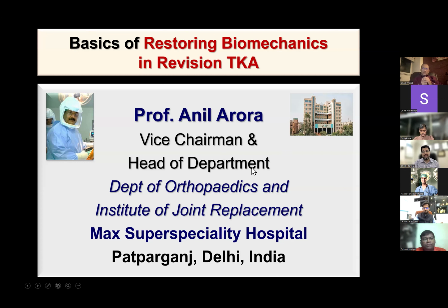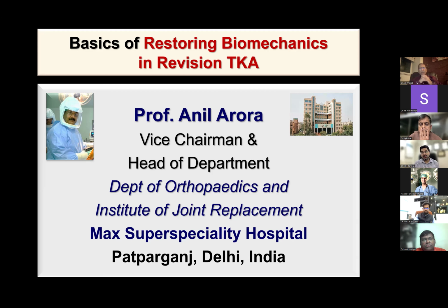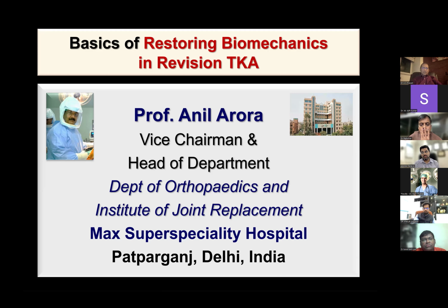How do you use cement for fixation in a revision TKR scenario? Normally, I use an uncemented stem, because a cemented stem will be the exception. Okay. And I saw the case where you put cement in that sleeve. Can you shed some more light on that? Actually, the smallest size of sleeve is to be cemented, so that's why it was cemented. The direction for the smallest size of sleeve available is that it will be used with cement. It doesn't have so much fixation. Okay, point taken, sir.